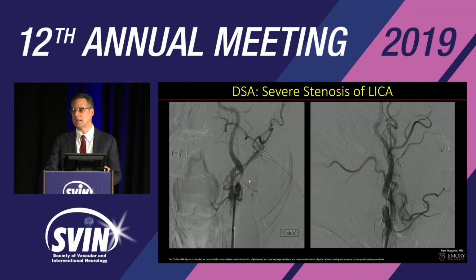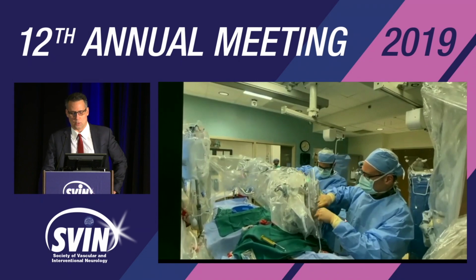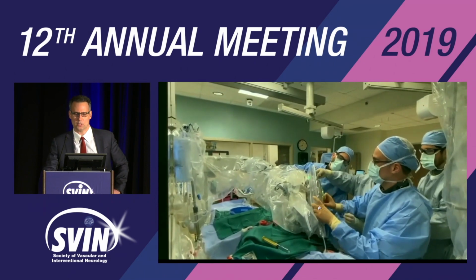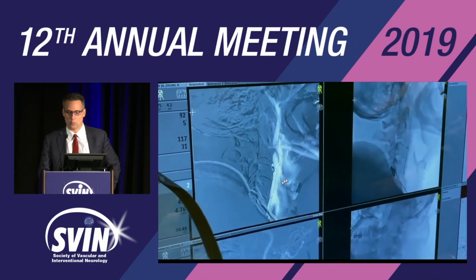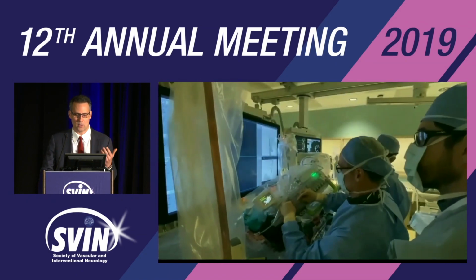So here is the baseline angiogram. For the baseline angiogram, the robot doesn't help you yet. You have to do it the standard way, then you bring the robot. So once the catheter is in place, you bring the robot, and I'll just show you some of the steps. Here I am essentially loading my wire with, in this case, a 6mm Spider filter, okay? And then you can load both systems and you can cross the lesion very easily. This thing is extremely sensible, extremely responsive.